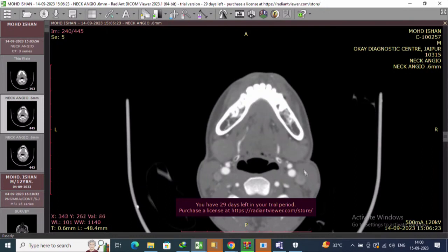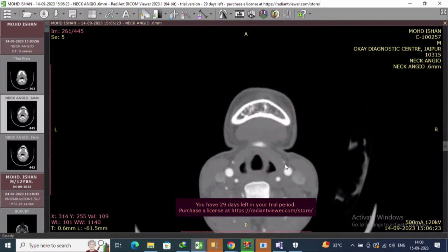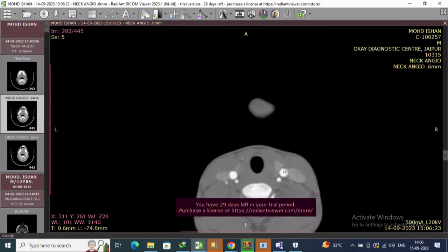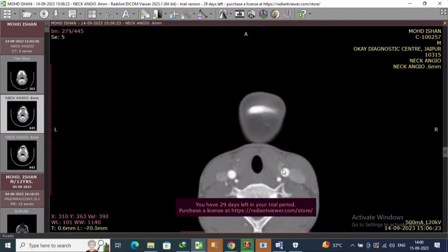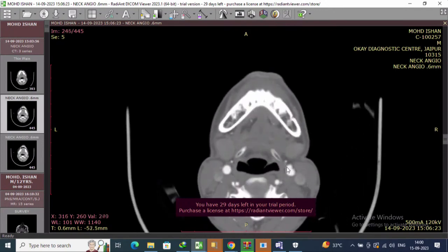How to track this? Forget about the carotid, now focus on this branch. See, the branch is going down. This is thyroid. Can you see this thyroid? So this is the superior thyroid artery. Can you see this? Yes, sir. Clearly seen. Ascending pharyngeal would go up.